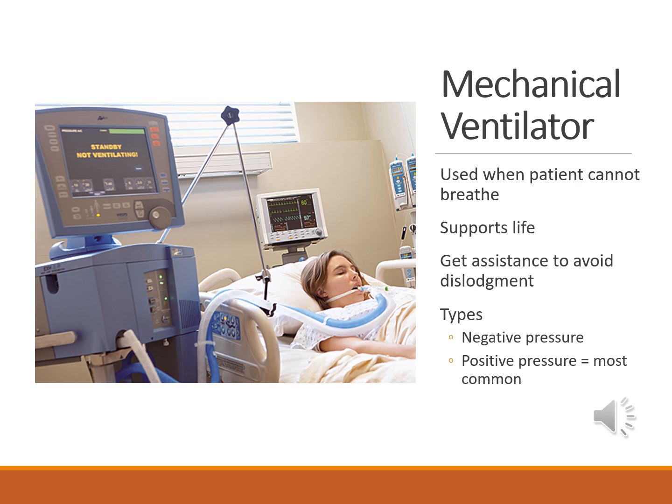You always want to consult with a nurse before starting an imaging procedure on a patient that is connected to a positive pressure ventilator. Some precautions to follow include getting help to move the patient safely, avoiding pulling on intravenous lines or ventilator tubing, keeping the ET tube or tracheostomy tube in place, not unplugging the ventilator, not disconnecting the spirometer, and if the patient appears agitated or confused, stopping and informing the nurse immediately.